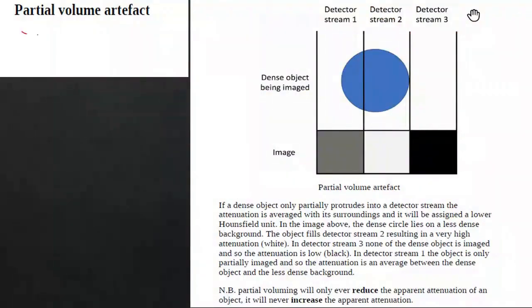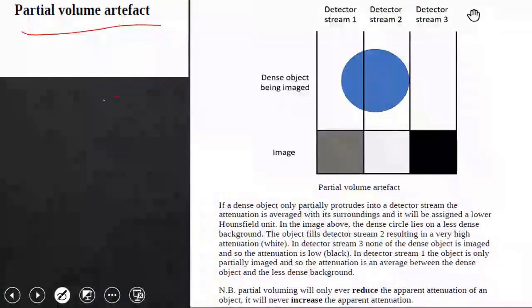There is something, the partial volume effect, which is well known. Involving the liver and lesions, you might scroll through the images, unsure if this is a focal lesion or due to the partial volume effect, requiring more info. You work and remain confused about whether this situation is legitimate or not, and you have to adjust in order to eliminate the effect of the partial volume effect so that you can see clearly.